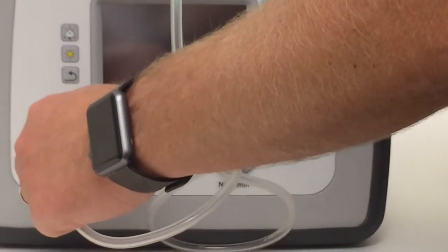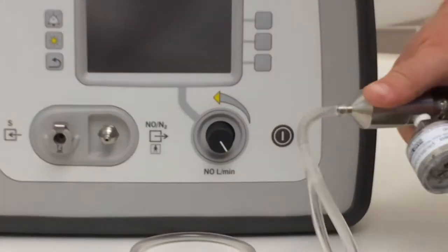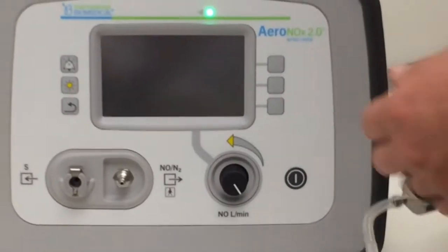That CAL circuit is going to plug in here. We're not going to do that until we turn the unit on and turn the gas on, or else you'll get a check sample line indication.